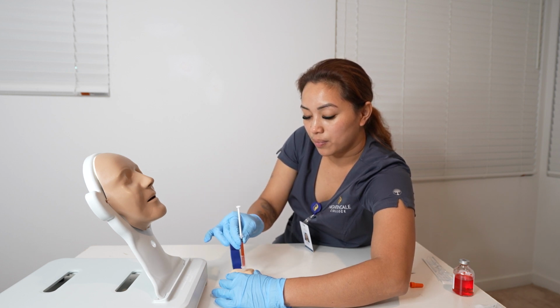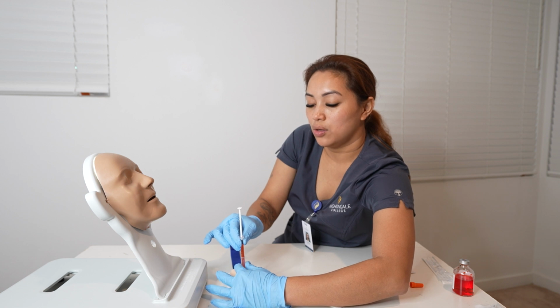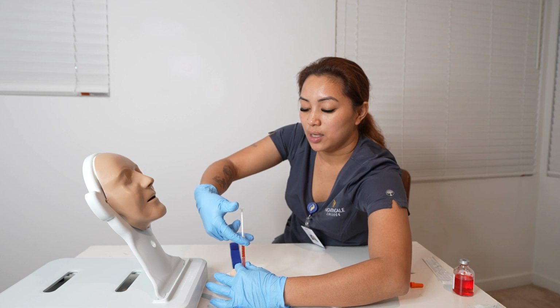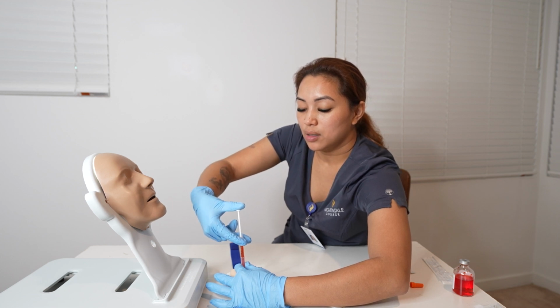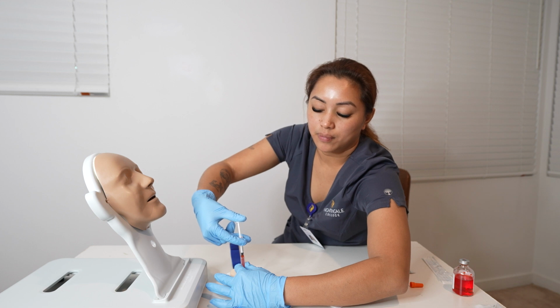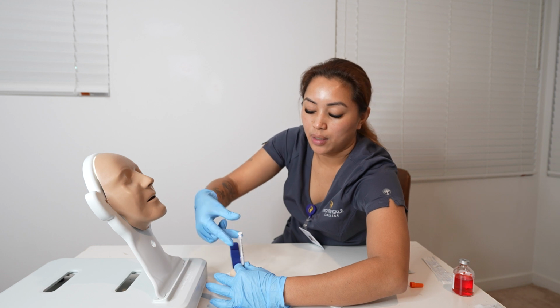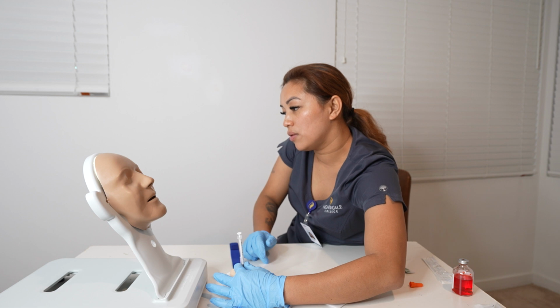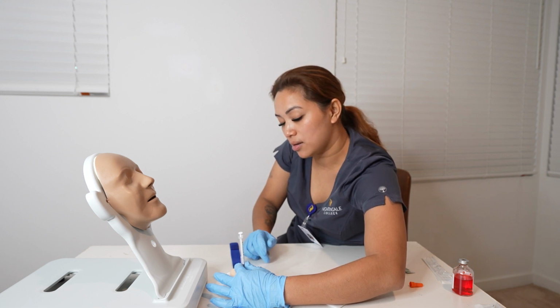All right. Now I am going to hold the syringe barrel with my non-dominant hand. Now I'm going to inject the heparin slowly into her belly. All right, let's just wait there for 10 seconds. 1, 2, 3, 4, 5, 6, 7, 8, 9, 10.